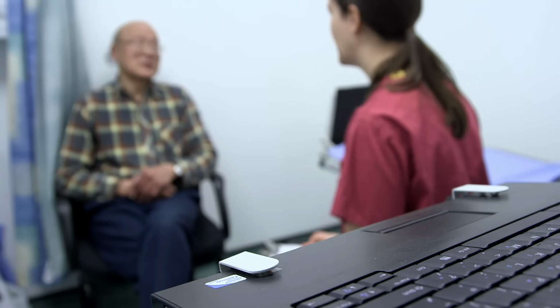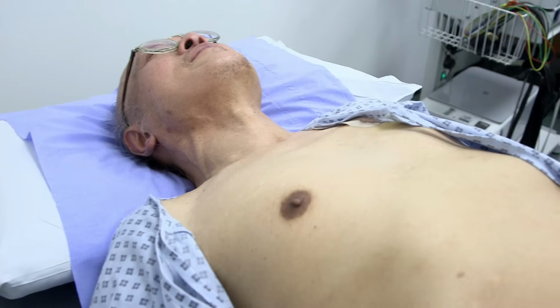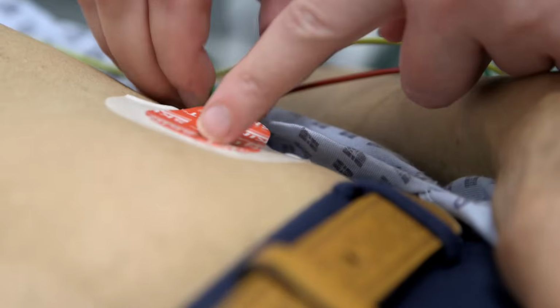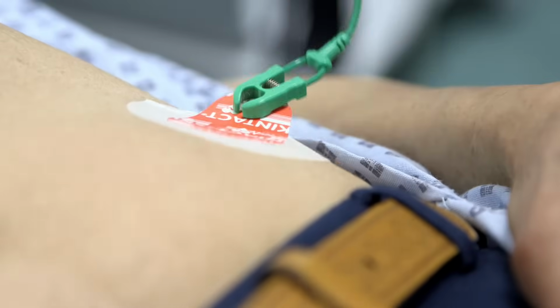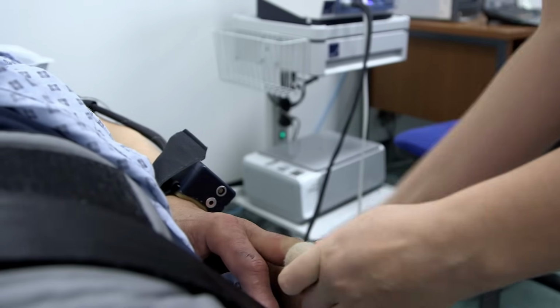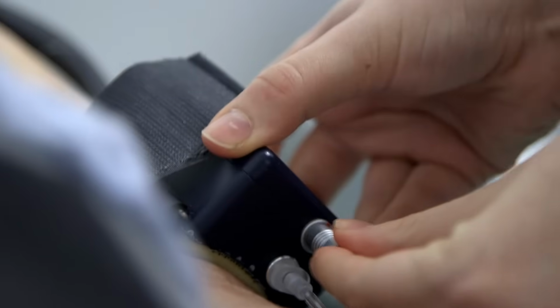So overall, a tilt test appointment usually is just over an hour, but the actual tilt test itself can take anything between sort of 15 minutes and 45 minutes actually tilted in the upright position. We get them to put a gown on their top half, and if you're a lady, you leave your bra on as well. Then we just attach 3 electrodes to the skin on the chest, and that's to record the heart rhythm. We put another blood pressure cuff on their arm, and then we put another device on their finger, and that also measures blood pressure. There we go.